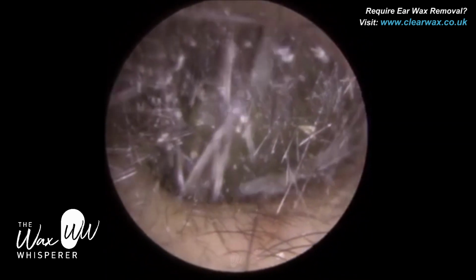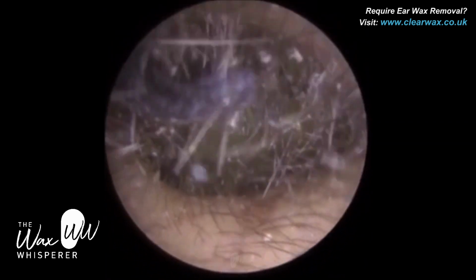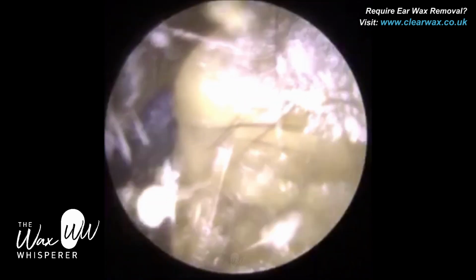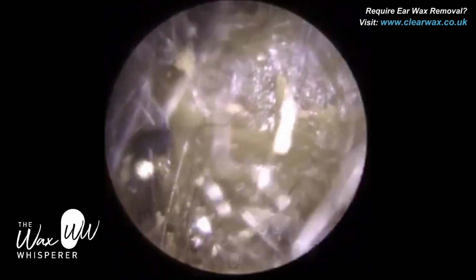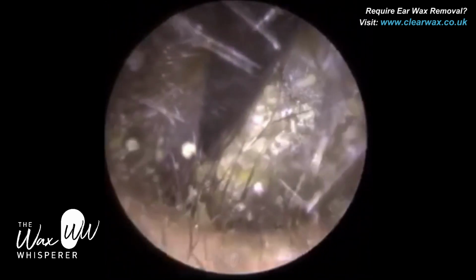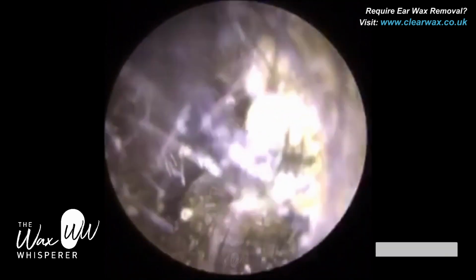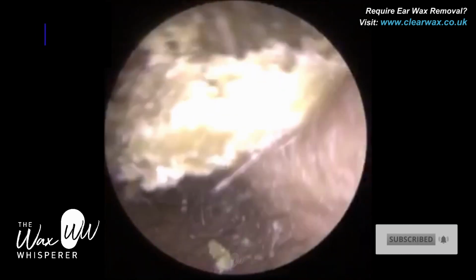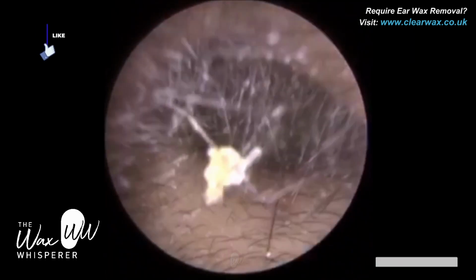The patient in this video attended with bilateral, so when we say bilateral, we mean both ears. Soft occluding, so the word occluding means the wax is creating almost an airtight seal, all the way around the edge periphery of the ear canal. Earwax. We just started off with the left ear.